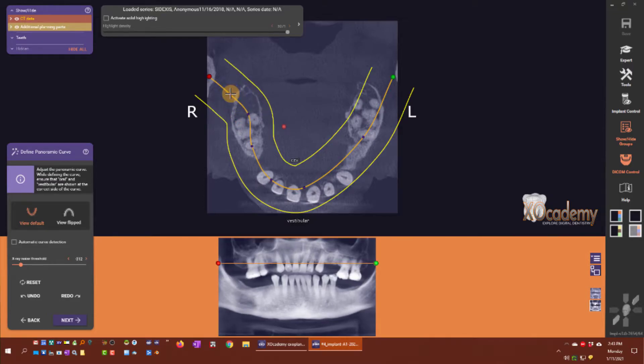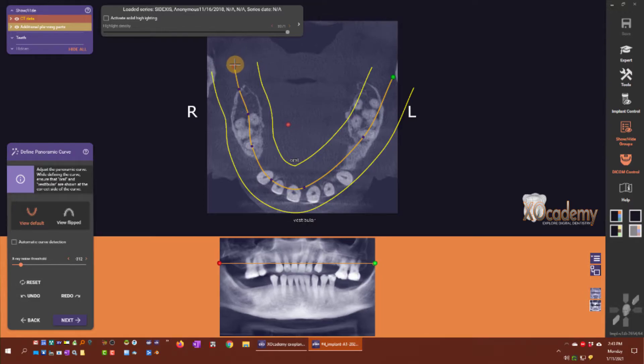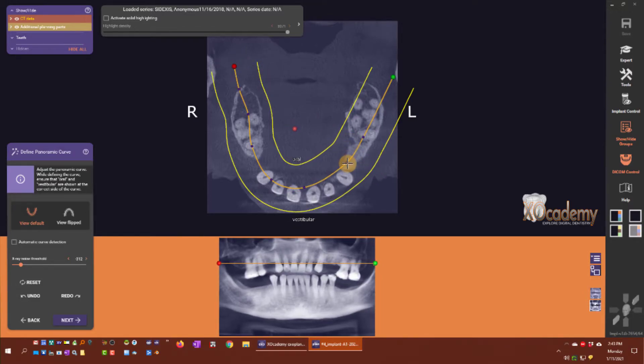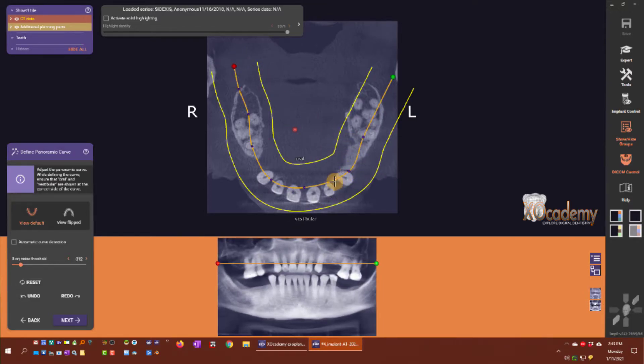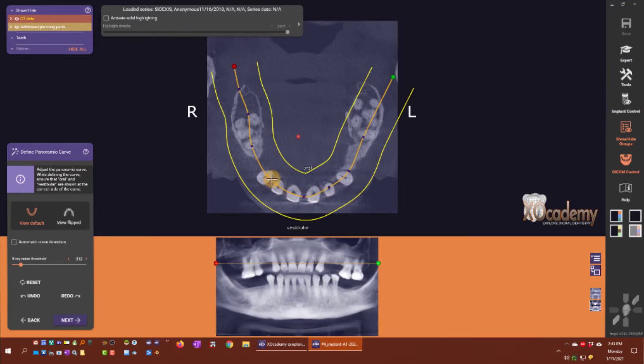I can say the curve comes out here a little bit to go over the middle of the teeth.